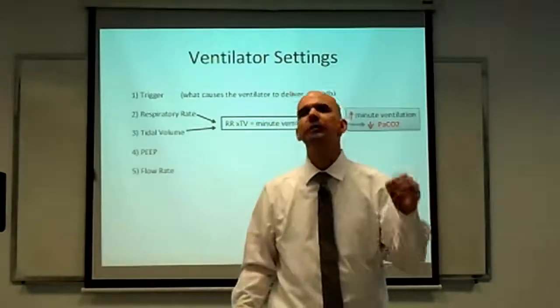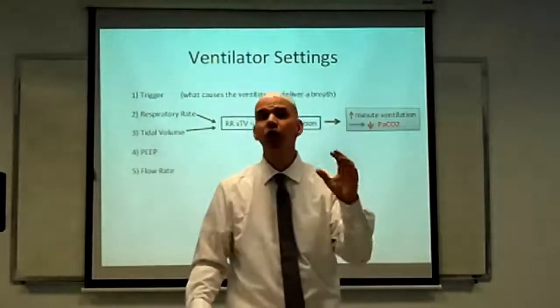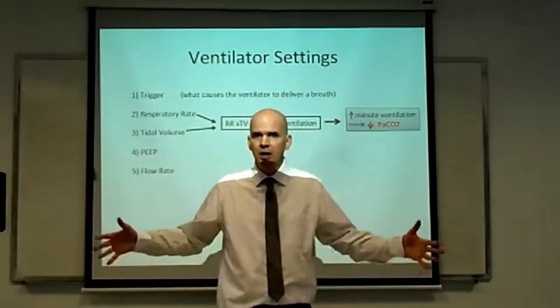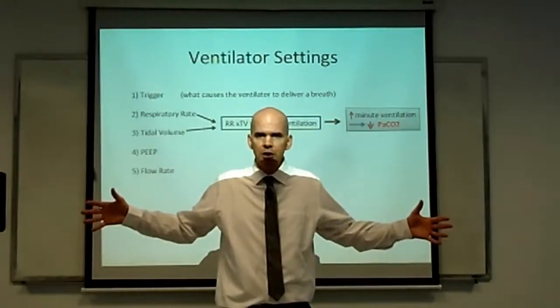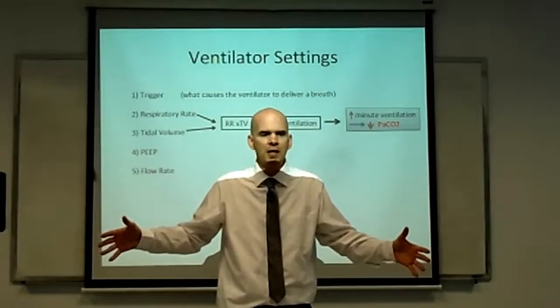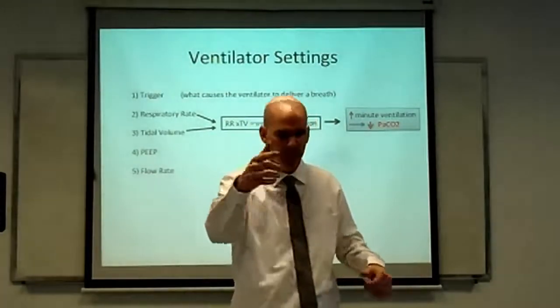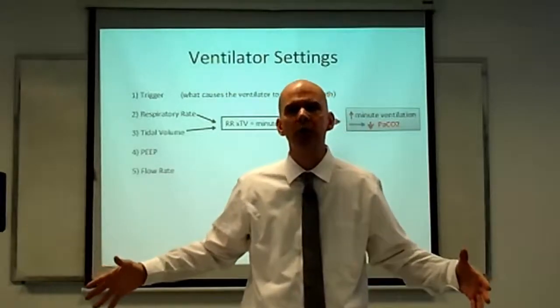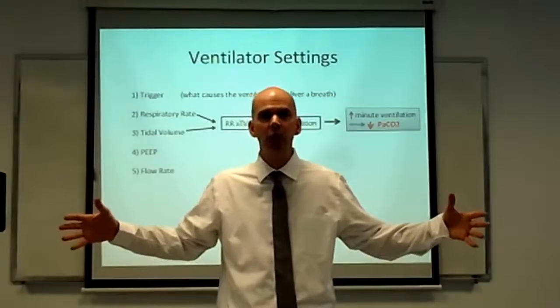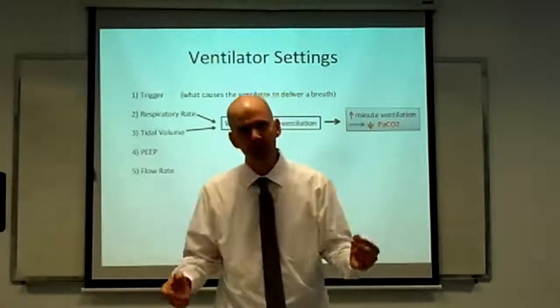And that's a real problem if the patient has COPD. COPD patients take a long time to exhale. So if it took a long time to inhale, then during their exhalation, they might be taking so long that they run out of time and a new breath gets delivered before they have exhaled all their old air. In this case, you get a breath stacking on top of the old one, and you end up with excessive stretch, and you end up with barotrauma.